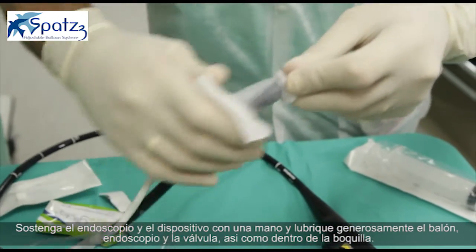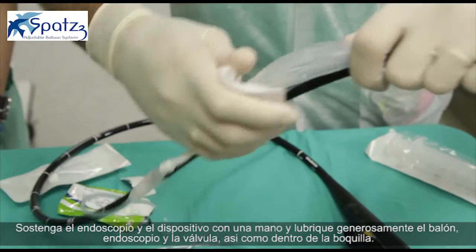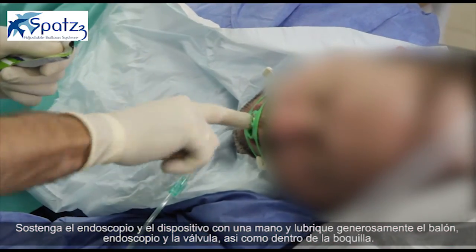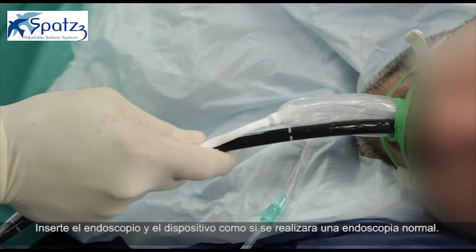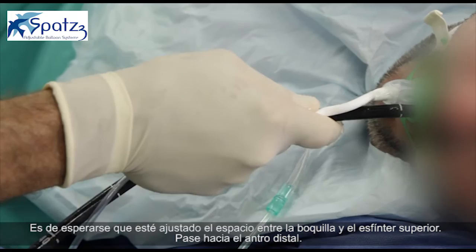Hold the endoscope and device in one hand and generously lubricate the balloon, endoscope, and valve areas as well as inside the mouthguard. Insert the endoscope and device as you would in a normal endoscopy. A snug fit at the mouthguard and the upper sphincter are to be expected.